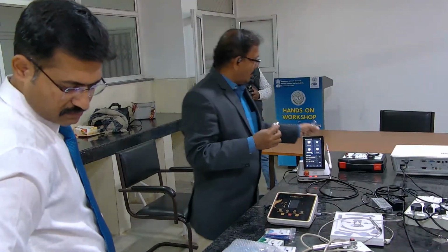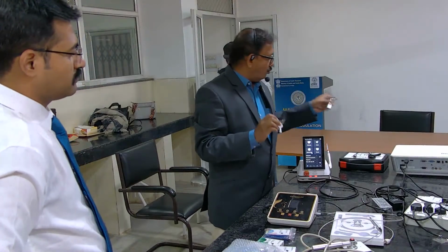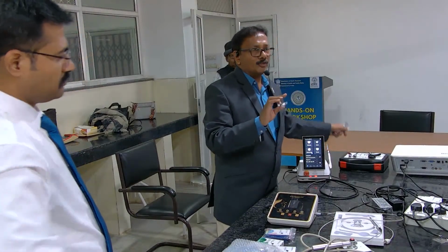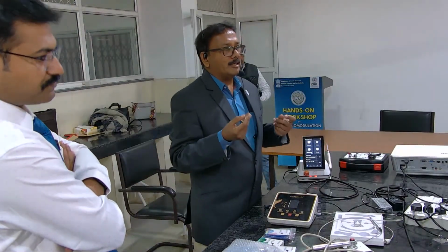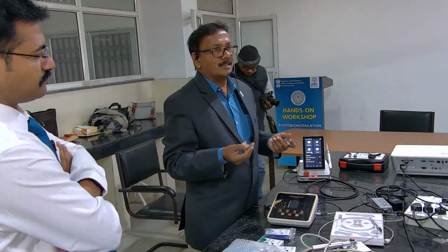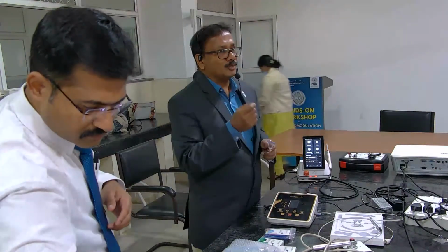That's all. Here you're using 1 watt. Here you're multiplying by 4 and keeping it at 4 watts. So 4 watts is the maximum you will be using. You are not going to use any procedure beyond 4 watts. Why would you need 10 watts, right? So these tips and tricks in laser you must know.